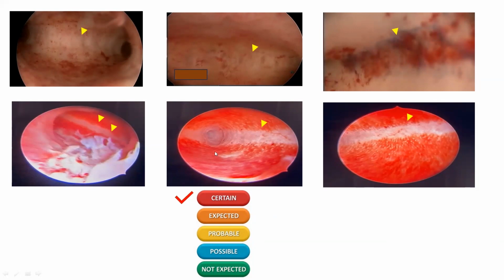And you can see here, even if the endometrium is inflamed by endometritis, you can see this line as a transverse line in the fundus, and it is not affected by the evidence of endometritis, which may signify that it is not covered by endometrium, because here is the endometrium inflamed, and this is pale without endometrium mostly, and this is endometrium. So certainly we observed this fundal defect in some cases, not in all cases of the hysteroscopic examination.